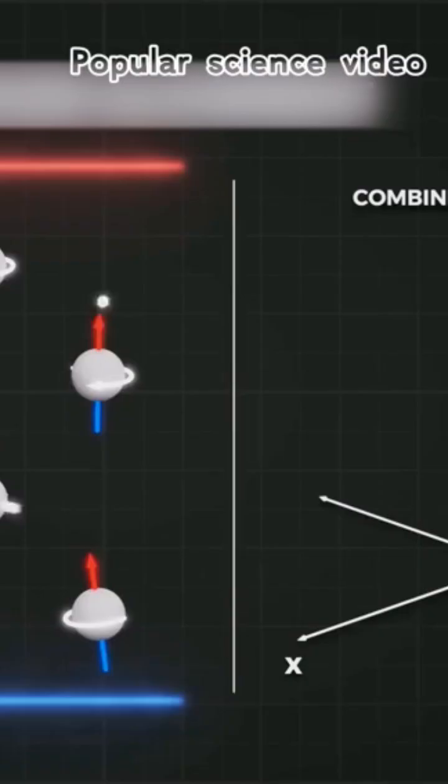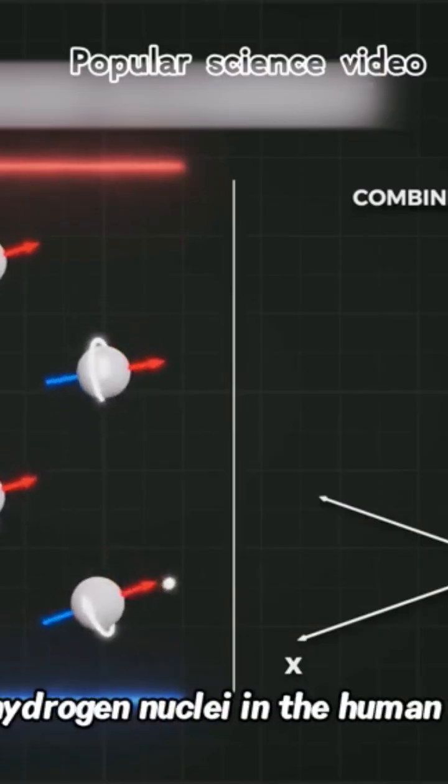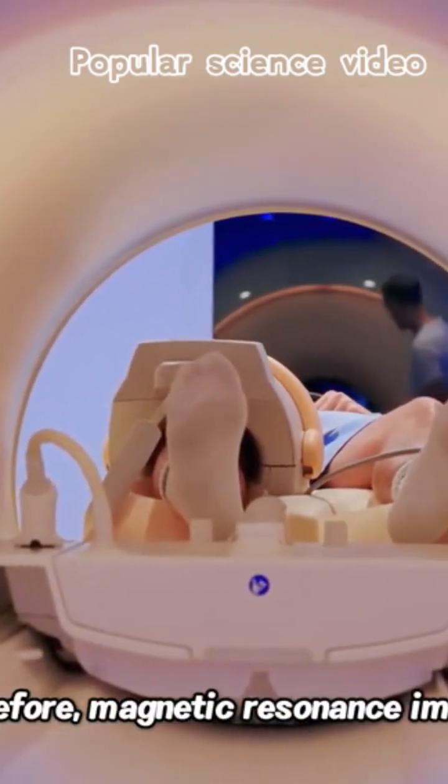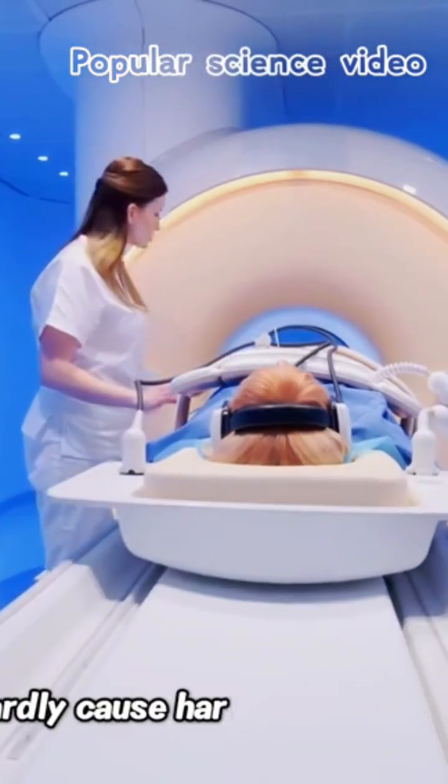is turned off, the hydrogen nuclei in the human body will return to the original state. Therefore, magnetic resonance imaging will hardly cause harm to the human body.